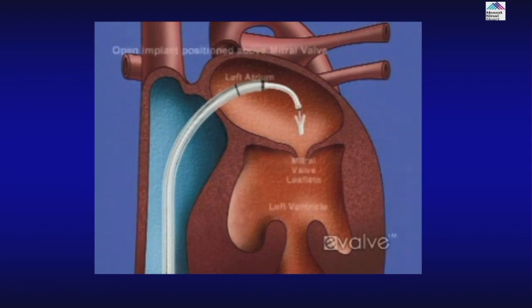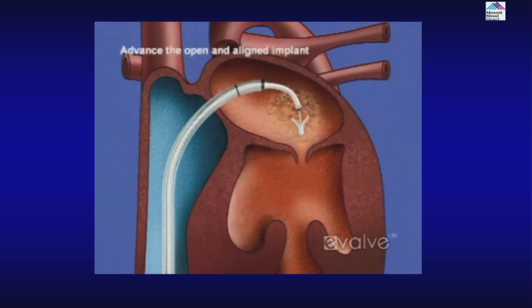like most procedures where interventionalists do it under fluoroscopy, this procedure is guided by the echocardiographer. So you have a TEE echocardiographer with you telling us where to do the transseptal. The key part of the MitraClip procedure is to have the right transseptal so that then your navigation of the whole device and placement of the clip becomes very easy.